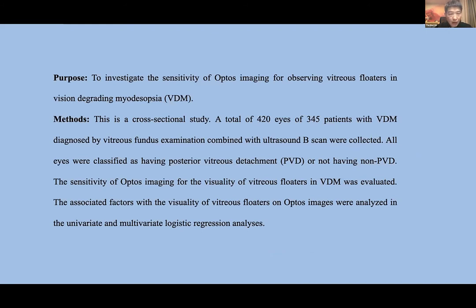The purpose of our protocol is to investigate the sensitivity of Optos imaging for observing vitreous floaters in vision-degrading myodesopsia. This is a cross-sectional study of a total of 420 eyes from 345 patients.